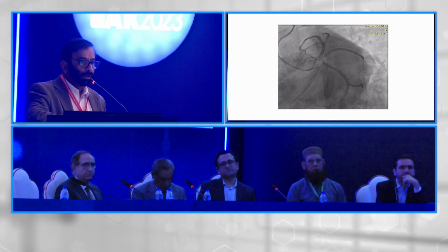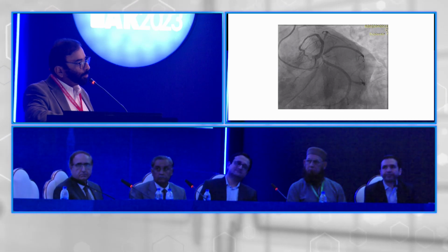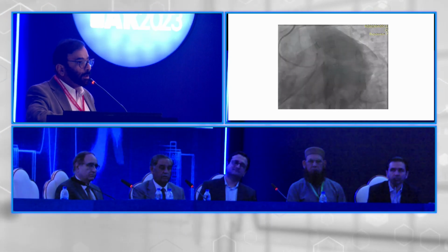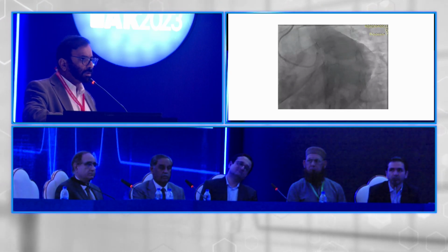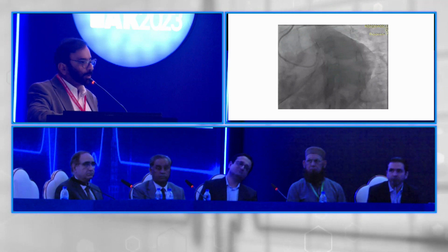Okay, thank you. So you know, there were multiple comments. Harun talked about 3 wires, Nawaz and Tariq Shafi talked about imaging, Asad also, and Kenny also, and then obviously Asad thought maybe getting into the left main. The rest of them were going with just a nailing sort of approach. So this is how we approach the case.